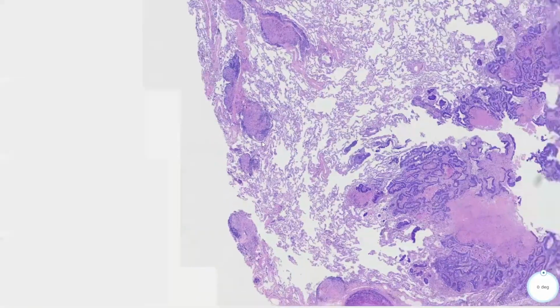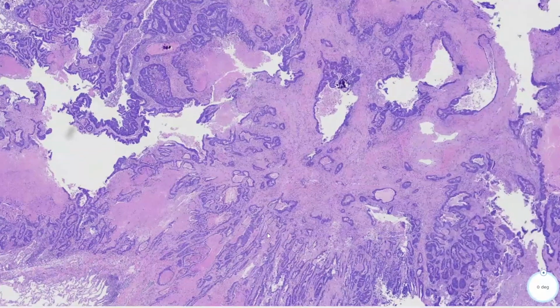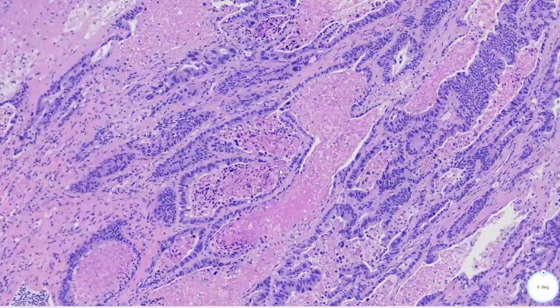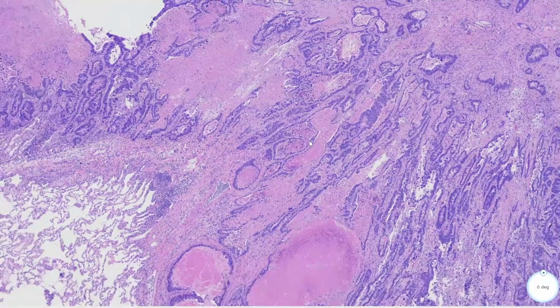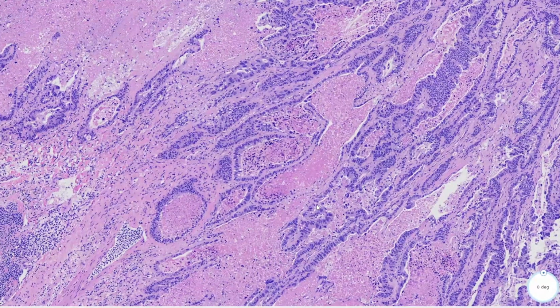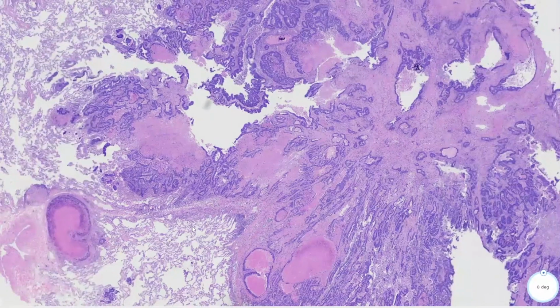So that's our first case. It's a metastatic colorectal carcinoma that shows infiltration of complex glandular structures with a desmoplastic stromal reaction. It has this intraluminal necrosis, or dirty necrosis, of the cells. An important point to remember is that the immunophenotype can lead you to think about colorectal cancer, but it's not completely specific, as a subset of lung carcinomas can also be positive for CDX2 with a more enteric immunophenotype.